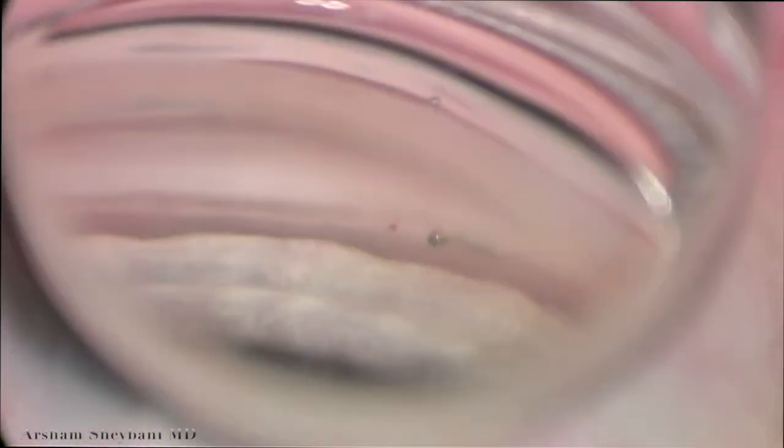Now you can see the stent is well seated. I'll show you a before and after photograph — this is before, and you can see how superficial the stent is, although it's in tissue. And this is after. It's well seated behind the trabecular meshwork.